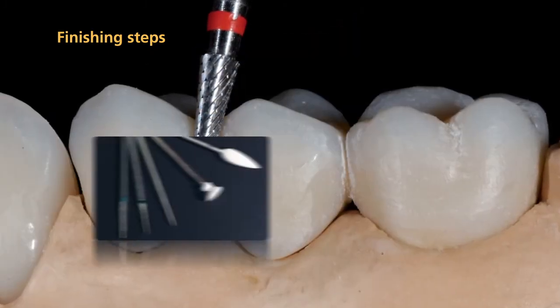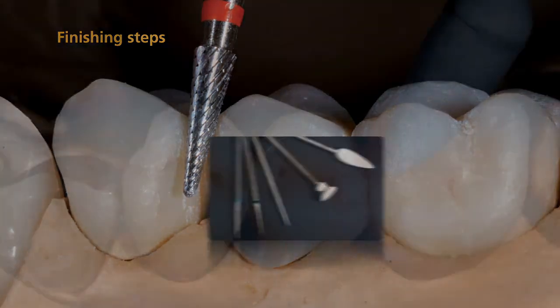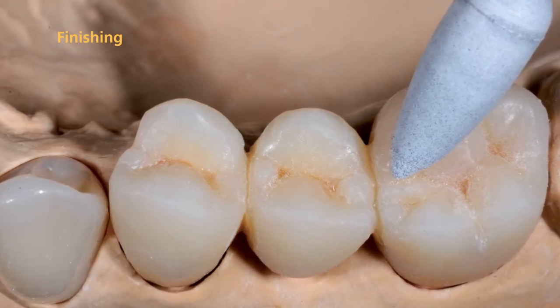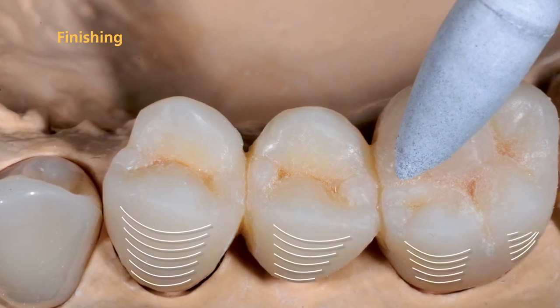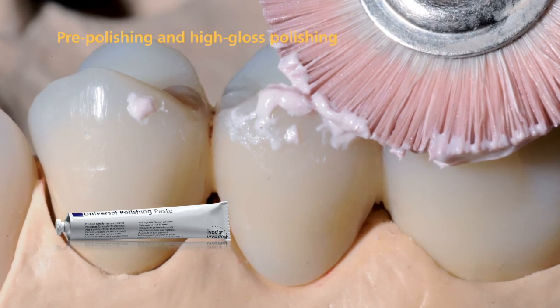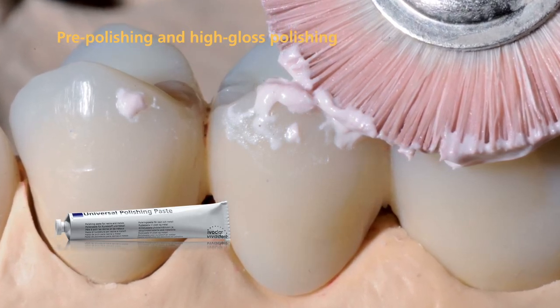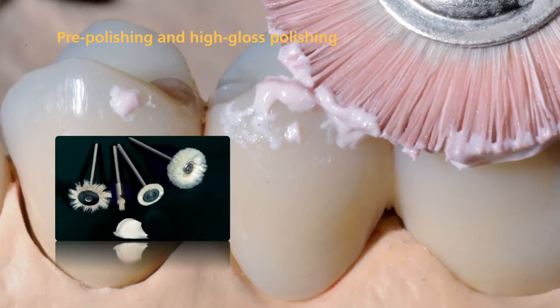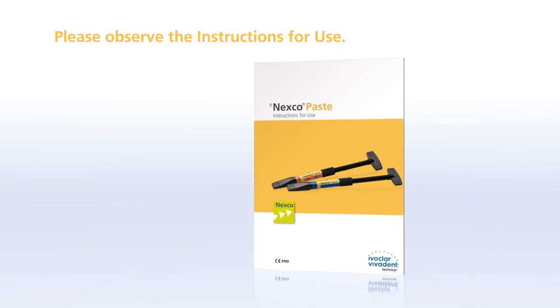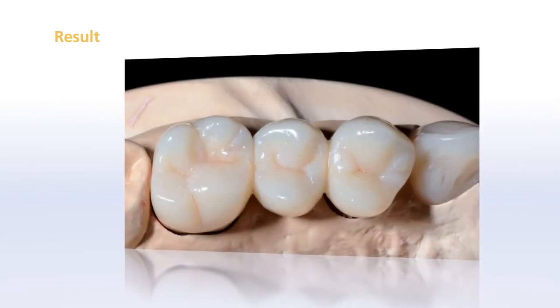Finish the restoration with cross-cut tungsten carbide burrs, fine diamonds, and flexible discs. Create a true-to-nature shape. Smooth the SR-NEXCO surface using customary polishers such as rubber polishers or silicone wheels. Subsequently, establish a lifelike surface texture in the buccal area. Next, pre-polish the surface using universal polishing paste and a goat hair brush, paying particular attention to the crown margins, interdental areas, occlusal surfaces, and the basal rest of the pontics. Use a cotton or leather buff to achieve a natural high-gloss finish. Please refer to the instructions for use for further details. With its lifelike aesthetics and vibrant expression, the final result is impressive.